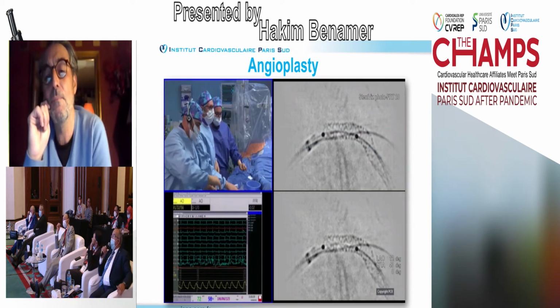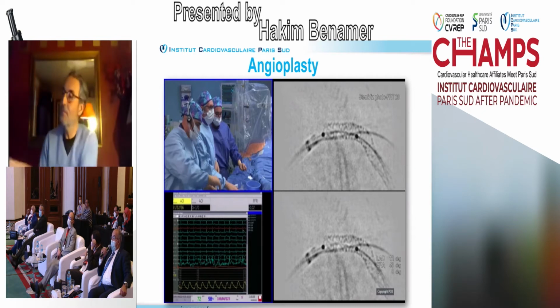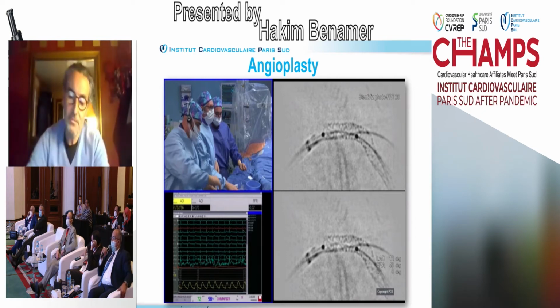Dr. Said: Dr. Hakim, my question is, I totally agree with the 1 stent strategy you did from left main to LAD. But what is your objection to using 2 stents, one fitting the distal diameter and another overlapped one fitting the proximal diameter in the left main? I totally agree with what you did, but what are the objections?